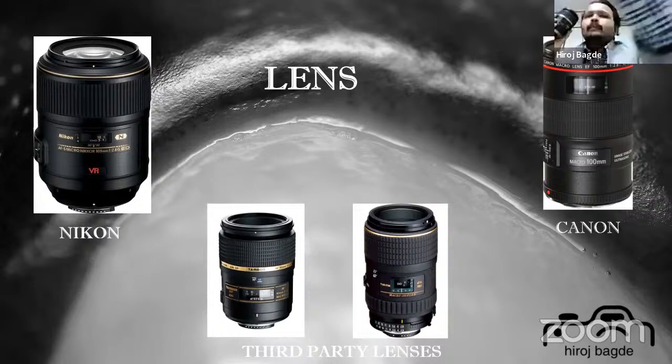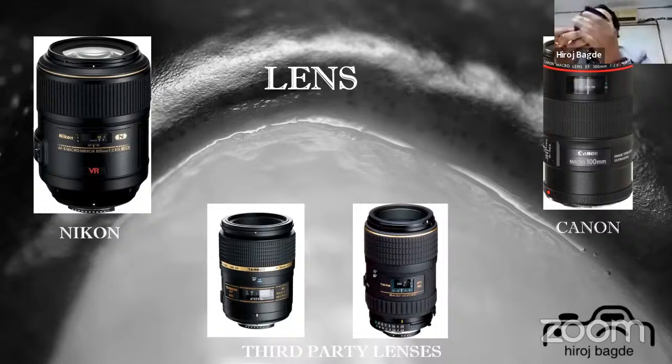This is a third party lens which has a shutter. Can you see the lens? It just opens and closes. Now the disadvantage of this lens is this barrel: when I go towards the 1:1 ratio and open the lens, it is going towards 1:1 ratio.